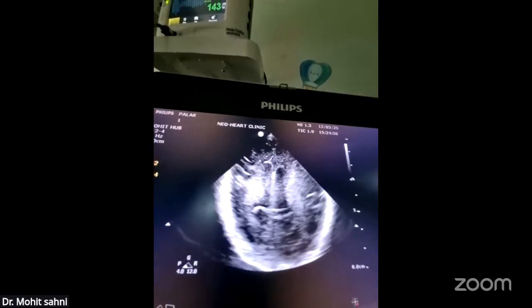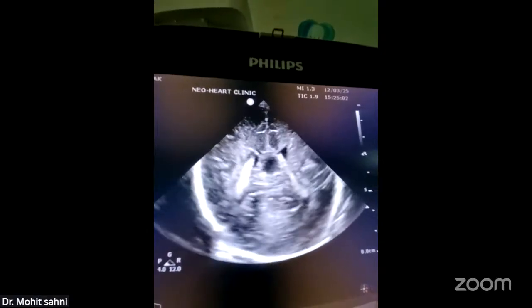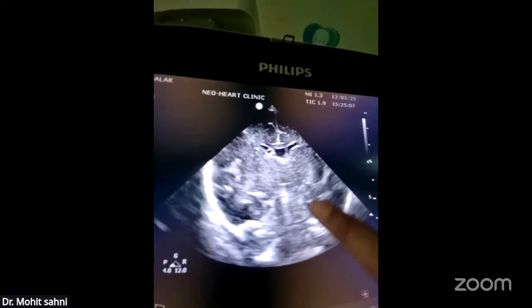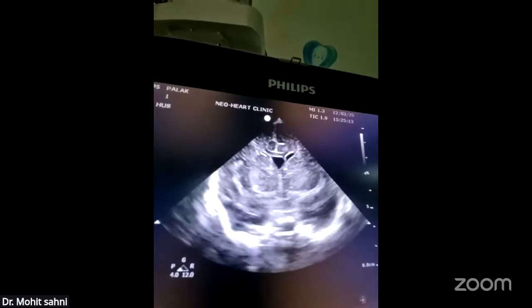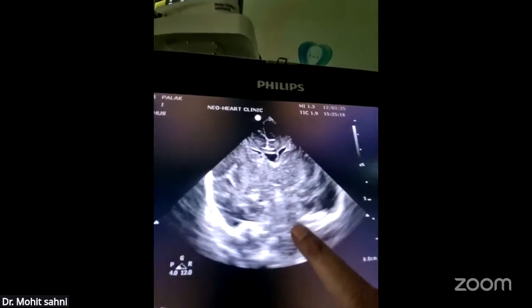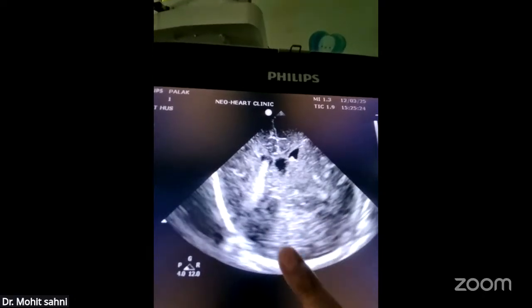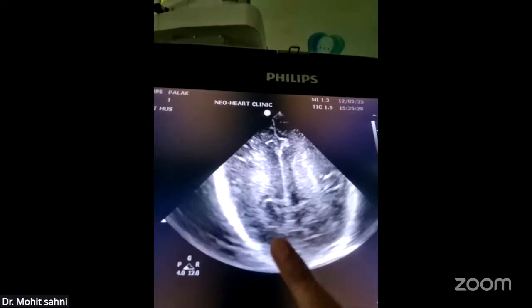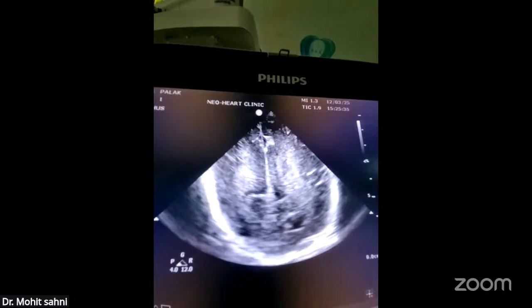And then when you go more posterior, you will see the occipital lobe. Now from C4, see this is C3, and this is C4, the 3-dot view. You start seeing the cerebellum. Till C3, the cerebellum is not very clear. From C4, that is the 3-dot view, you start seeing the cerebellum. And in trigon view, where the choroid plexus is seen, you can see the cerebellum very nicely here. So you have the cerebellum clearly seen in coronal sections C4, 5, and 6.